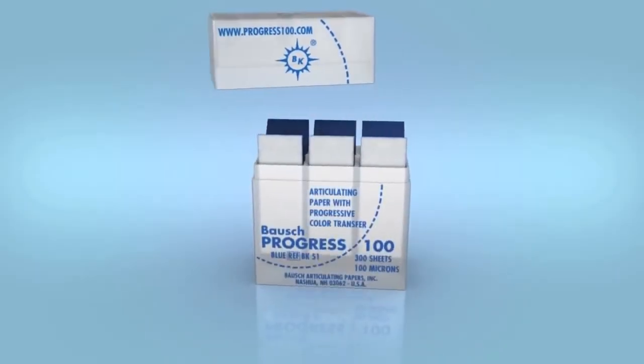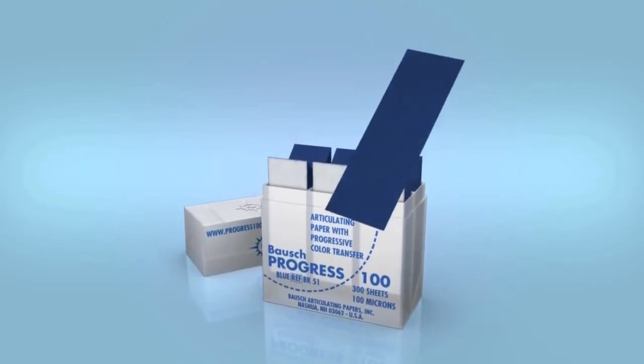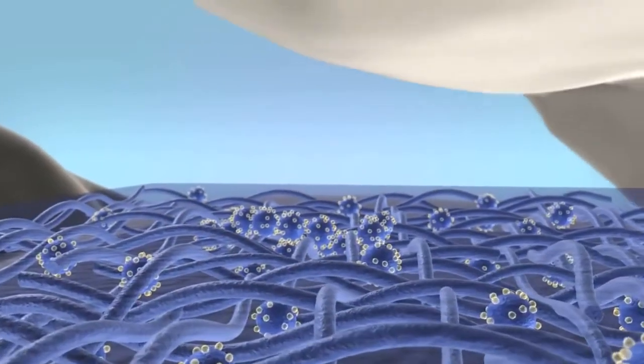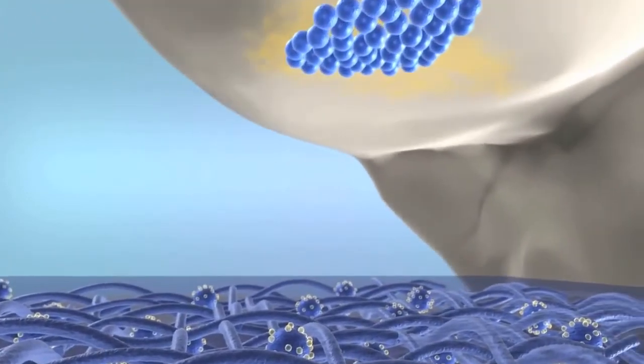Bausch Progress 100 — articulating paper, 100 microns, with progressive color transfer. This new, smooth, reinforced paper with high coloring capacity adapts perfectly to the occlusal surfaces.